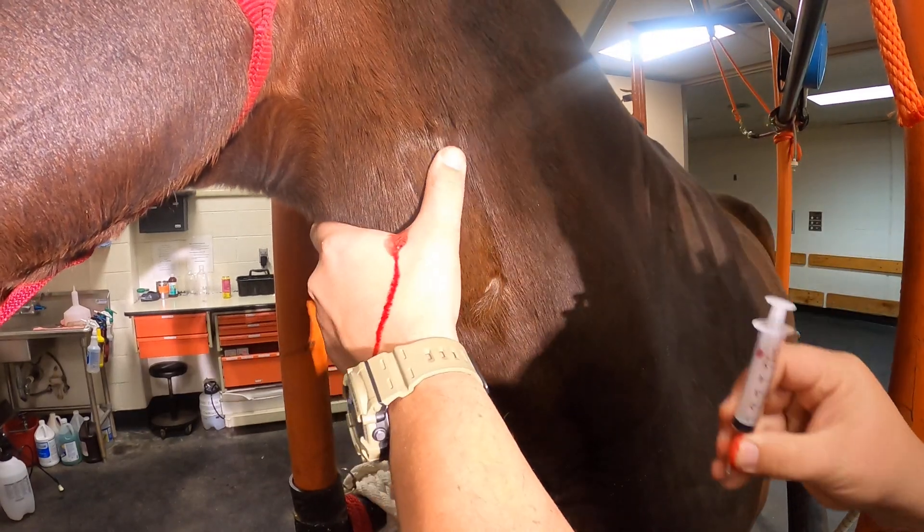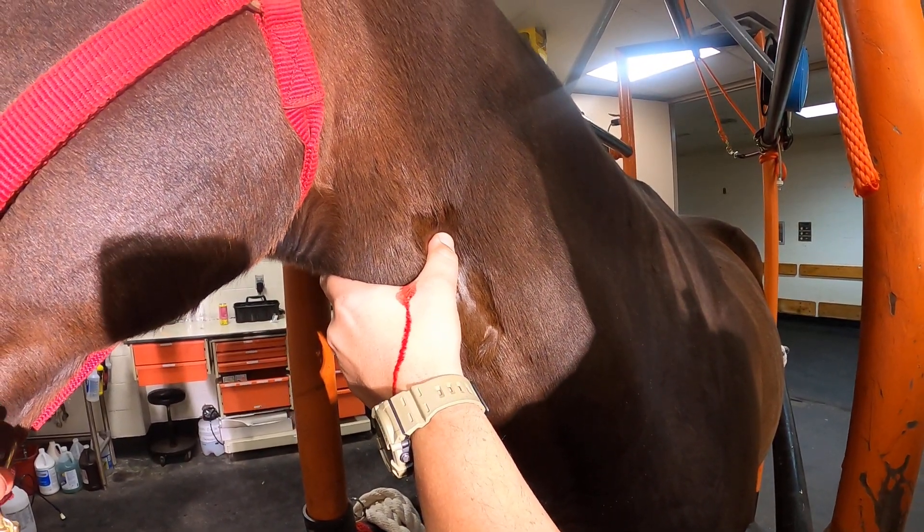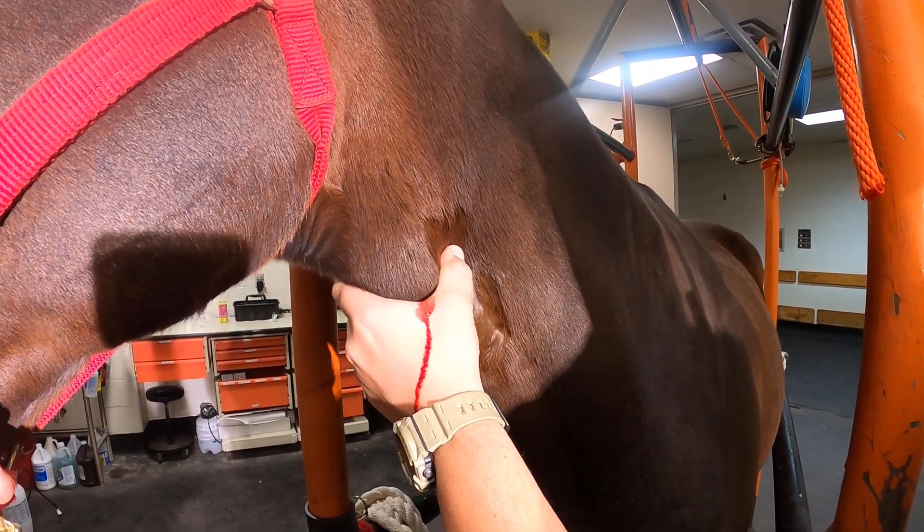Once injected, we place the thumb right over our injection site for just a few seconds. This will help control any subcutaneous hemorrhaging from occurring.